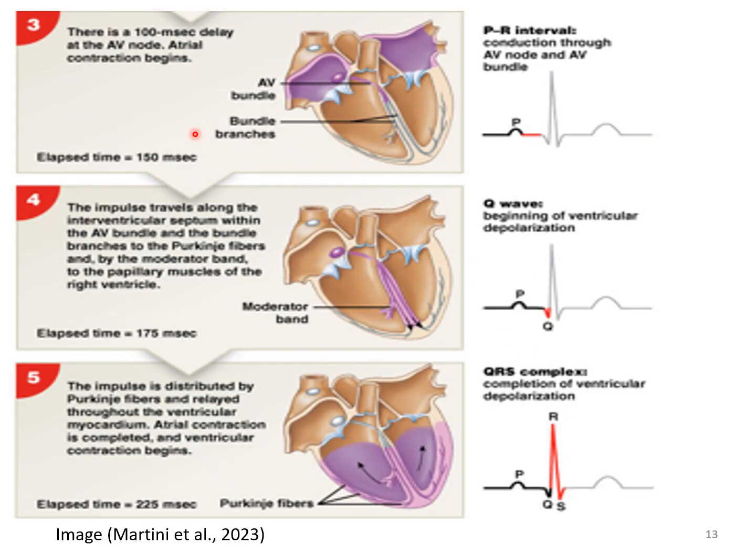Okay, and right here, whenever we see the PR interval, it is reaching the AV node, and going towards the AV bundle. So the AV bundle is between the right and the left ventricle. Okay, as we discussed earlier, if the PR is more than 200 millisecond, it means that there is some delay in going from the atria towards the ventricle.